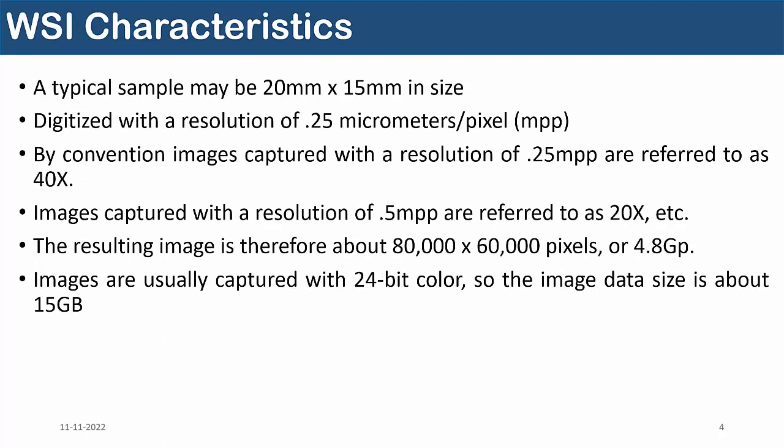These whole slide images are extremely large. If I take a typical sample of 20 by 15 size and digitize it with a resolution of 0.25 micrometer per pixel, that is MPP, these are going to be huge images, because they can be magnified up to 40x or 20x, or if you go for a lesser MPP value, you may get up to 100x images as well.